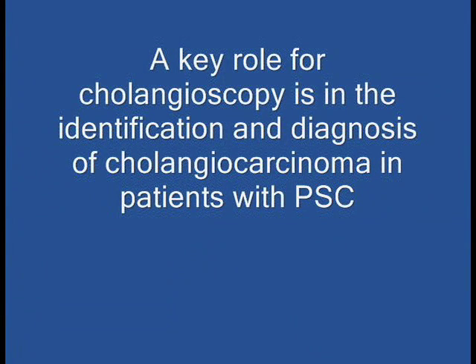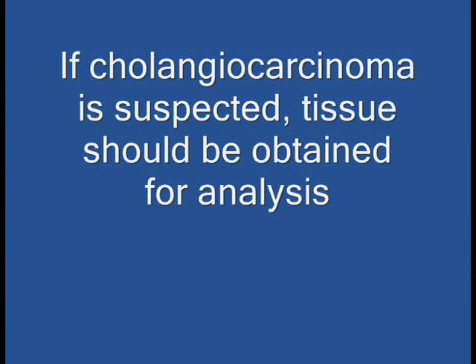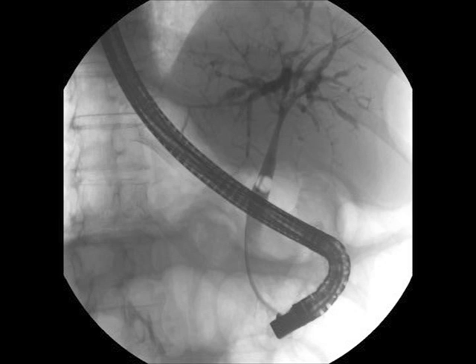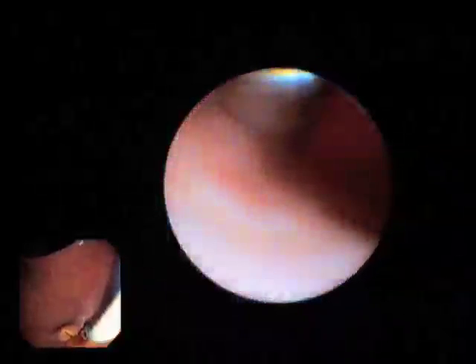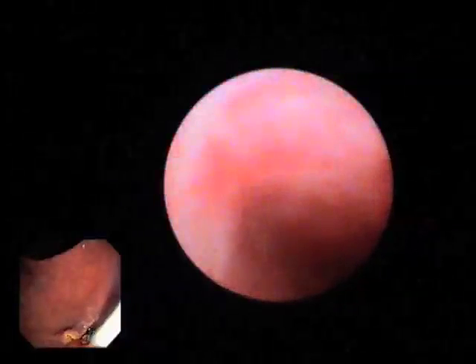A key role for cholangioscopy is in the identification and diagnosis of cholangiocarcinoma in patients with PSC. If cholangiocarcinoma is suspected, tissue should be obtained for analysis by cytology, FISH, biopsies, or a combination thereof. This patient has a common hepatic duct stricture and intrahepatic ductal dilation. On cholangioscopy, a smooth but bulky area of tissue is seen at the level of the stricture with significant narrowing of the duct lumen. This is highly concerning for cholangiocarcinoma on appearance. Multiple forceps biopsies were taken from this patient using the cholangioscopic biopsy forceps. The patient was found to have cholangiocarcinoma.